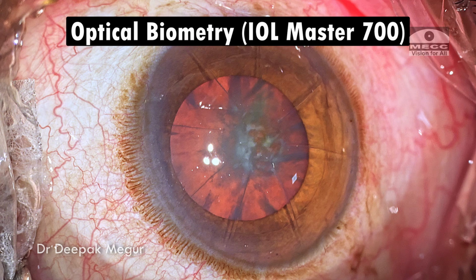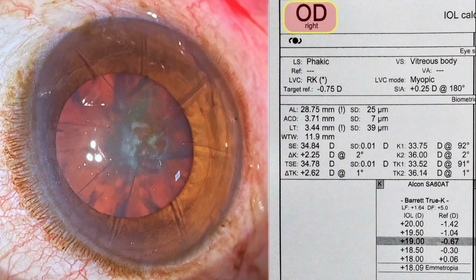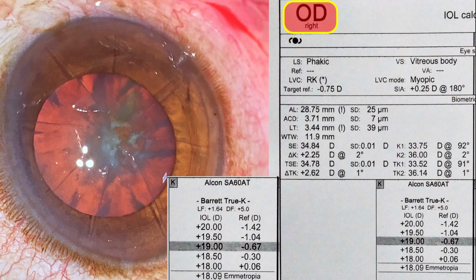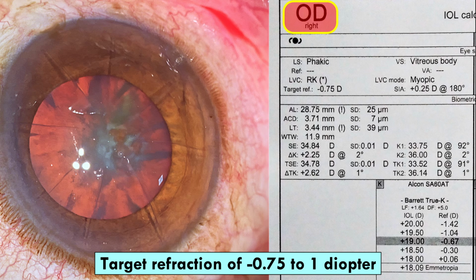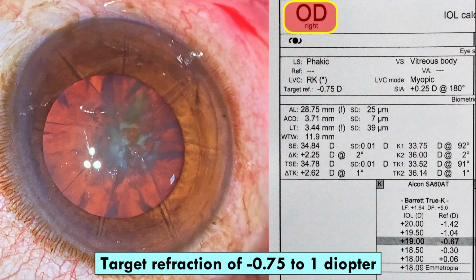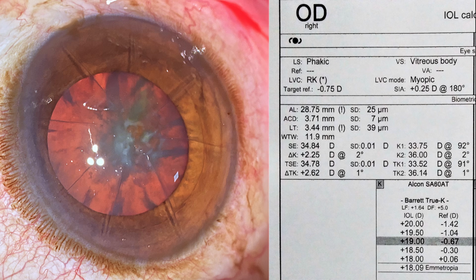The patient underwent optical biometry through IOL Master 700, and these are the reports, and then we compared it with the online calculator at the ASCRS website, and we aimed for a target refraction of anywhere between minus 0.75 to 1 diopter. Aiming for a target refraction with slight myopia is usually the best strategy, which has helped me when dealing with these post-RK eyes.